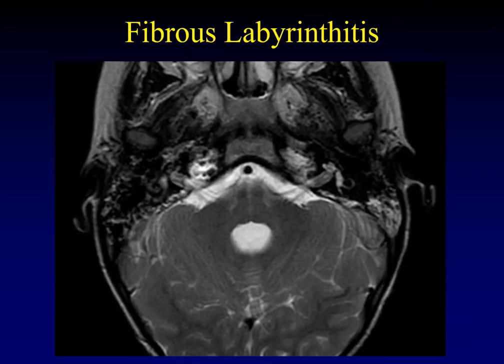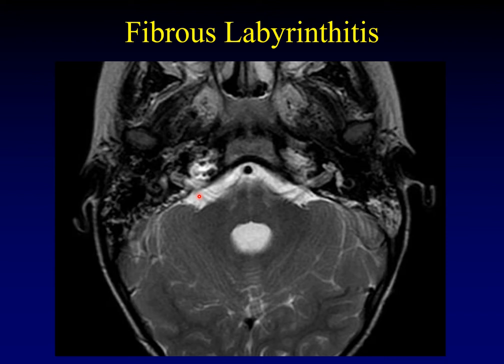Now comes the fibrous stage. Notice on the normal side, you have a beautiful image of bright T2 signal in the labyrinth, cochlea, and semicircular canals. If we look to the affected side, the cochlea is gone, the vestibule has a weird configuration, you can almost see a ghost of the lateral semicircular canal, but they're starting to fill in. We're starting to lose that endolymph and perilymph and the T2 signal that goes with them.